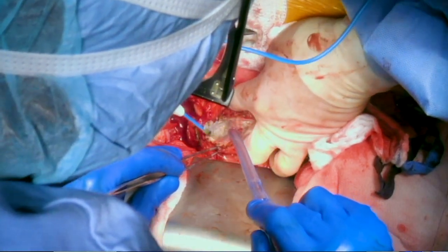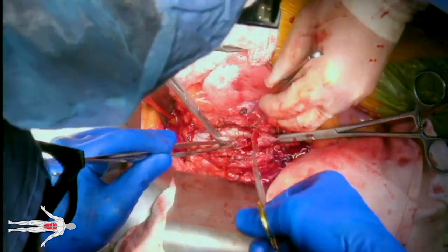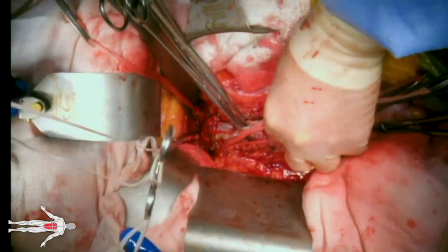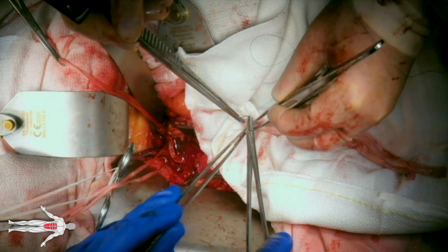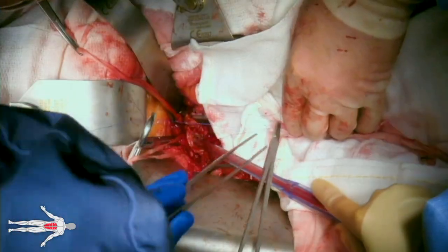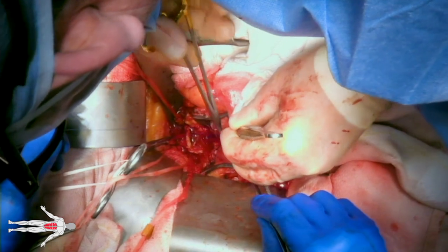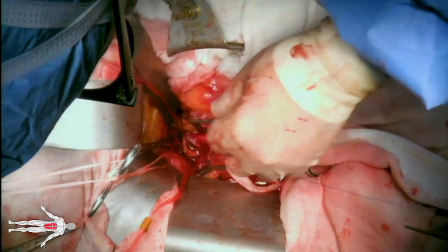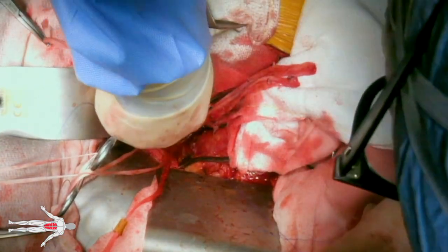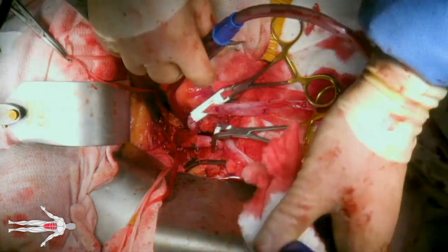Turning our attention back to the abdomen, the aorta is incised and the infected endoprosthesis exposed. The graft inflow and outflow are controlled with clamps and the graft is incised. At this point, a suprarenal clamp is applied and the proximal end of the graft is explanted. Our proximal graft-to-aorta end anastomosis is then constructed with a 3-0 Prolene suture and parachuted down to allow for optimal exposure. The proximal clamp is released and the graft anastomosis is checked for leaks.